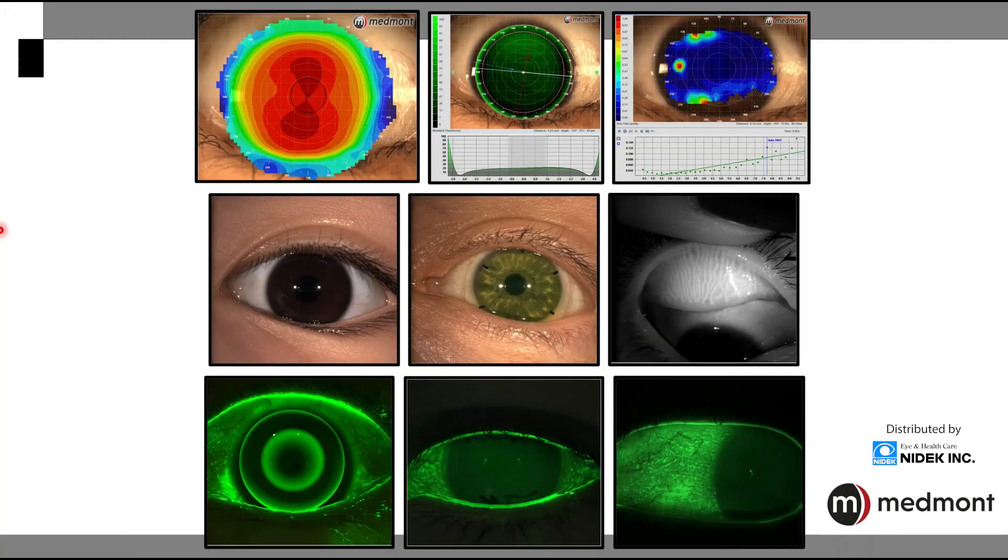The Medmont has always been known as the ultimate specialty contact lens tool, one that provides a large surface area of capture and accurate information so that we can best design our initial specialty contact lenses. But we also now have the ability to add an entire dry eye assessment to our practice. Additionally, we have numerous ways that we can now image and record video of the anterior segment in white light, in infrared, or in fluorescein. The Medmont Meridia is so much more than just a corneal topographer — it's also an incredible imaging device that can be used for so many functions and applications in your practice.